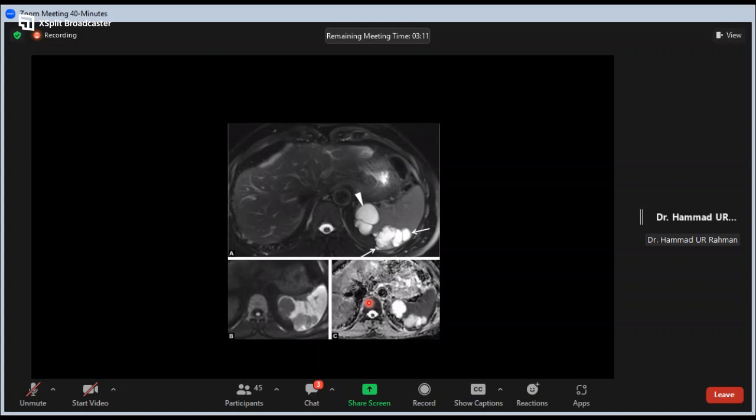So these are cystic, as you would expect from ovarian lesions. These are multiple cystic-cum-solid lesions which show some nodular post-contrast enhancement, and in the typical clinical setting of known malignancy, you can label them as metastatic lesions.